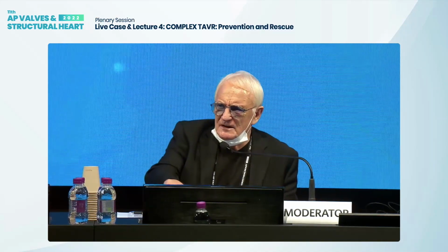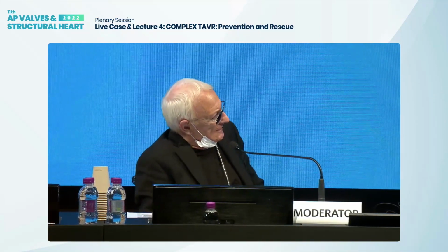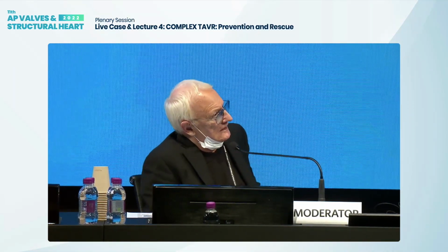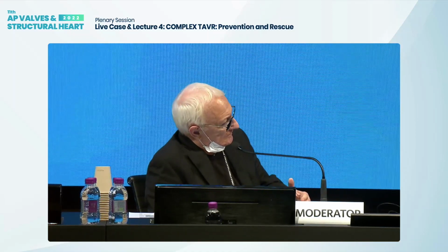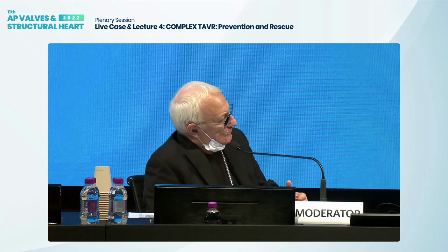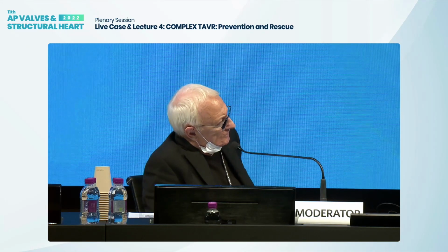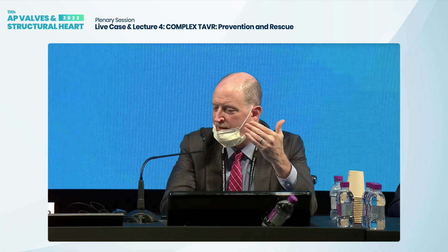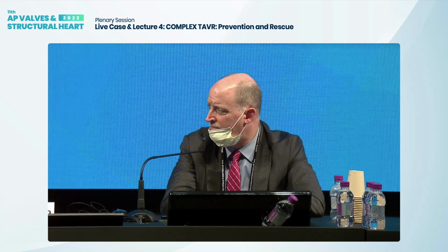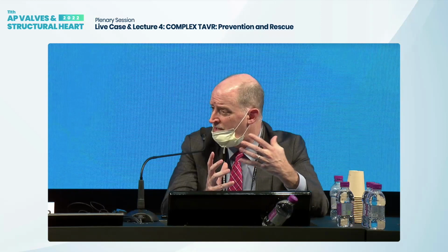While you're there, and we didn't discuss the small annular stuff, to be honest, I'm still puzzled, and I wonder whether maybe you could clarify my mind a little bit. If supraannular does play a role, isn't small annulus a good example of using supraannular valves versus balloon expandable intraannular valves? I totally believe that, depending on the age of the patient and how long they're going to live, and you're not worried about TAV in TAV. You'll definitely get a better hemodynamic result, maybe a better clinical result in those really small annuluses that have appropriate sinuses for a bigger supraannular valve.